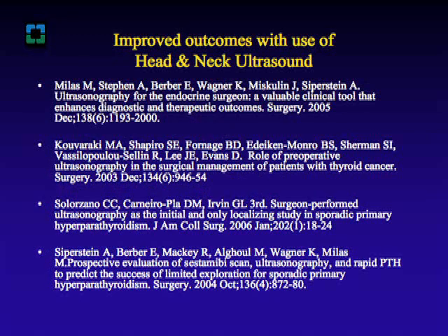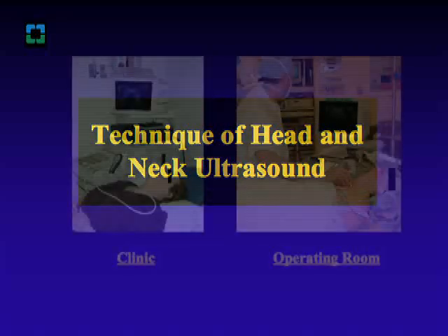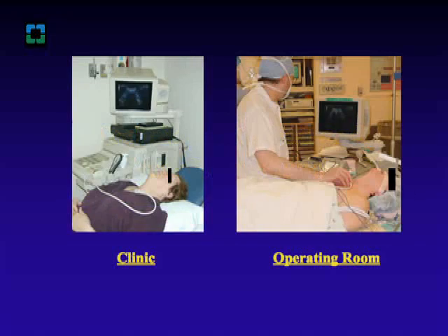Studies from our group and others have demonstrated that preoperative ultrasonography has a clear advantage in diagnosing and treating endocrine disorders, resulting in an alteration of patient management a third of the time. Ultrasound is non-invasive and simple to perform, both in a clinic setting and in the operating room.